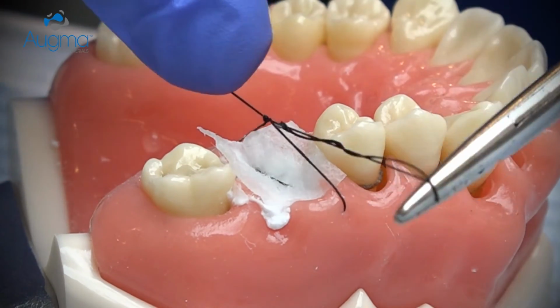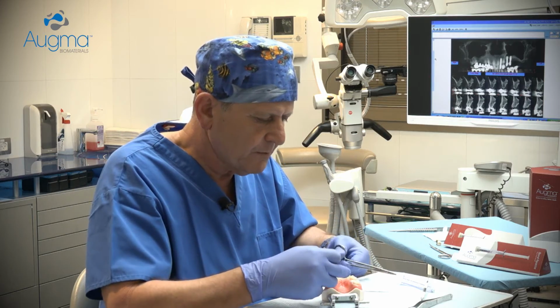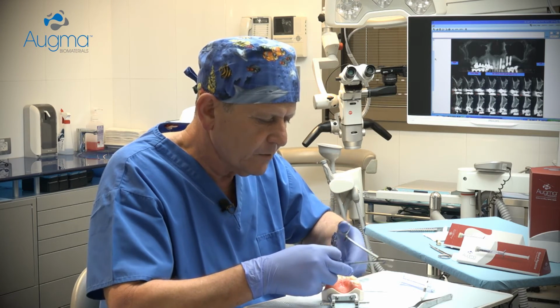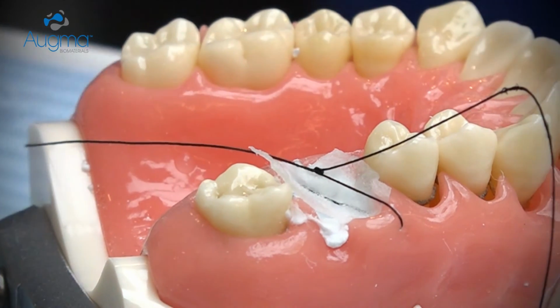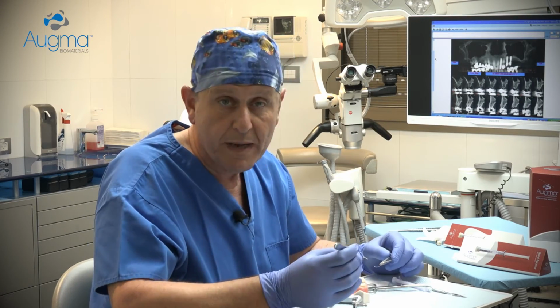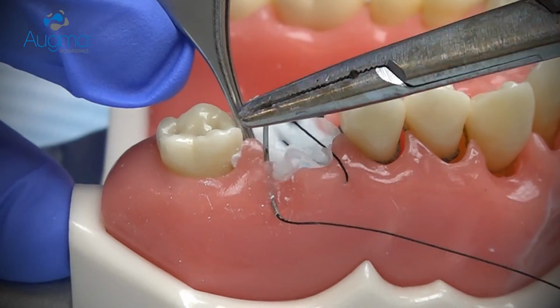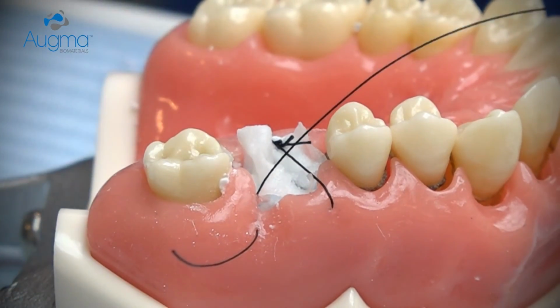To stabilize the collagen sponge in place. Now remember that the collagen sponge must be stabilized together with the soft tissue by its first knot. After stabilizing the collagen sponge in place, or the membrane in place, you continue with a crisscross suturing in order to protect it in a better way.